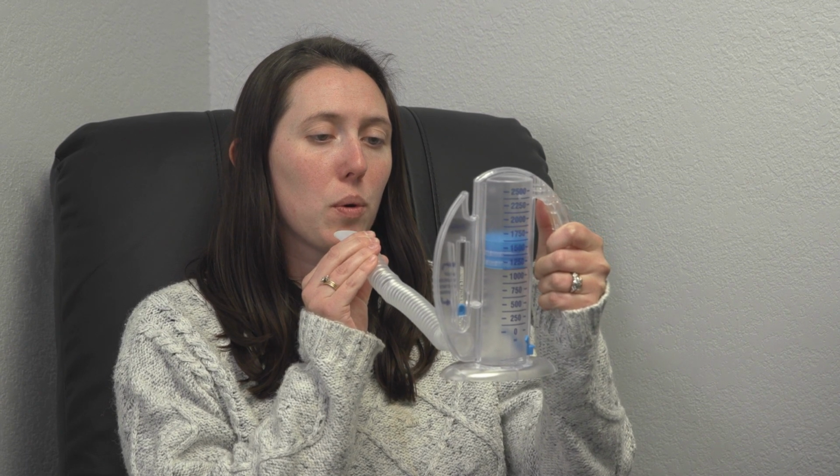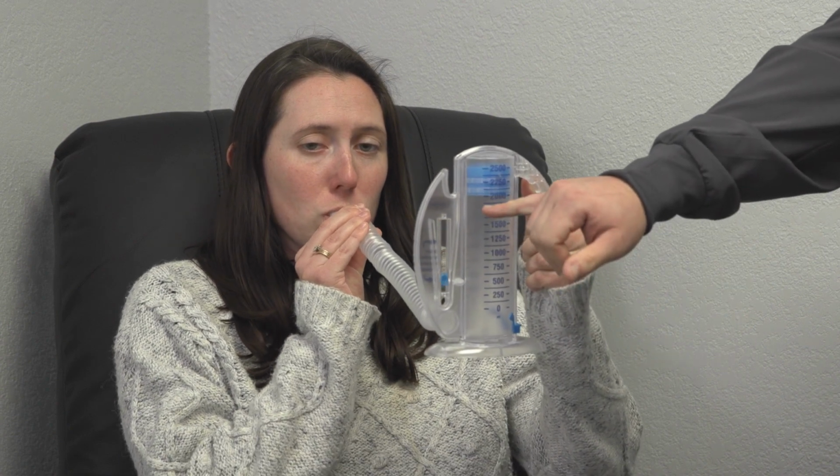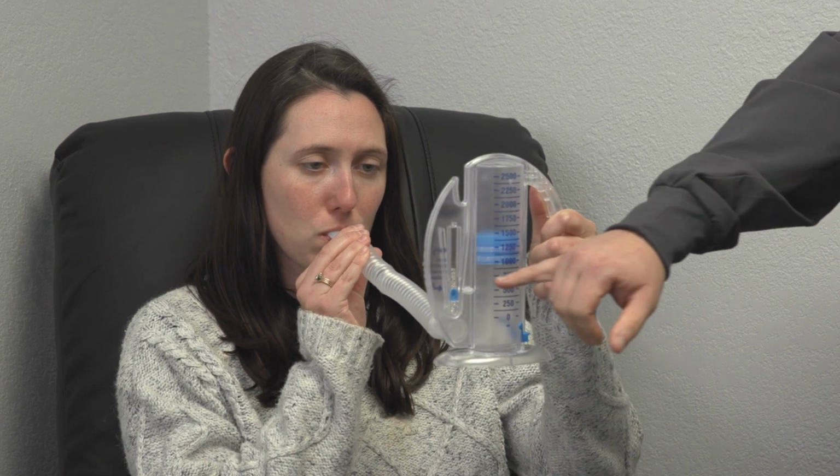Now I'll have Kelsey demonstrate what it looks like if you breathe in too hard. Focus on this blue tab here. See, as she's breathing, it shoots straight to the top. That means she breathed in too deep, too hard, too fast. And if she's not breathing in quite fast enough, it'll sit below the arrows, just like that.